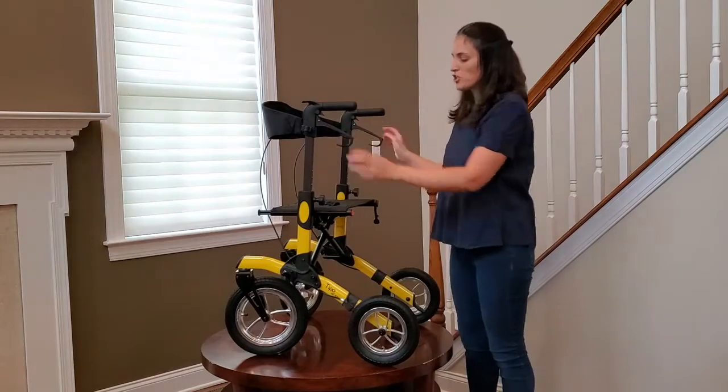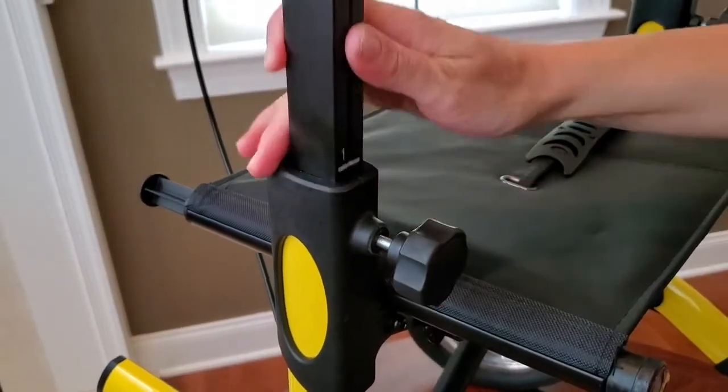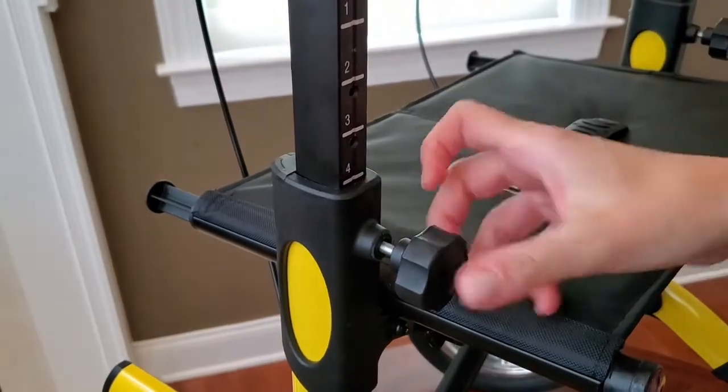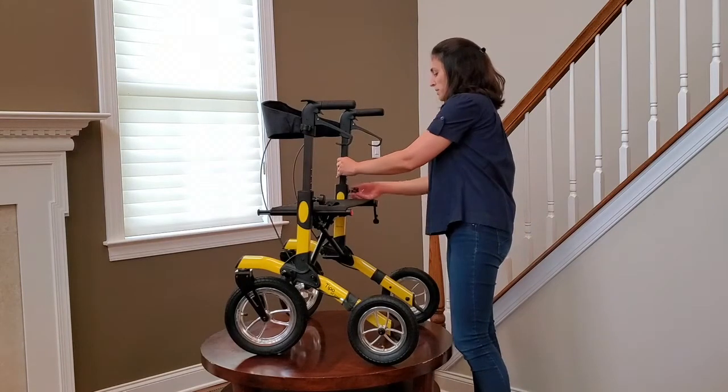Now you're ready to adjust the handle height. Find the knob, unscrew it, lift the handle up to the desired height, use the numbers as a reference, and do that on both sides.